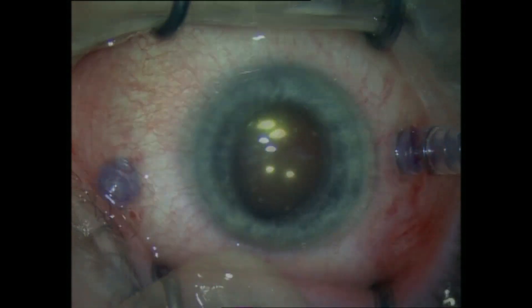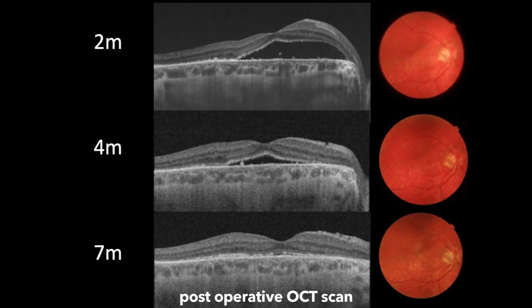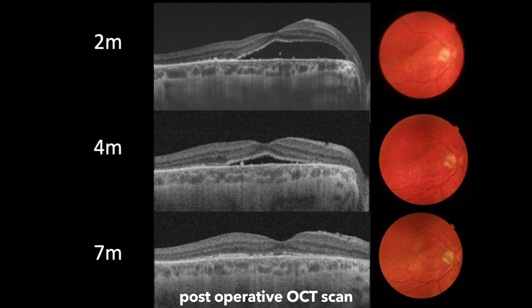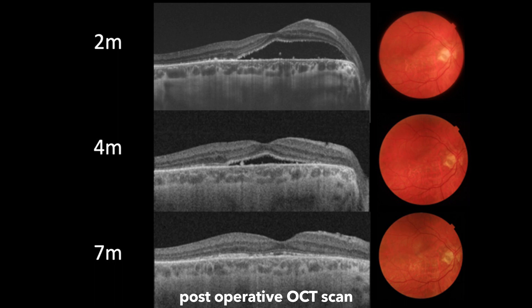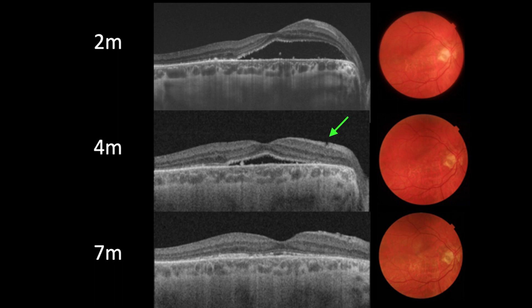All trocars were removed. The sub-retinal fluid gradually resolved after surgery, with complete resolution at seven months. The neural retina was quite healthy. One of the scans shows a very subtle defect, possibly at the area where the inner fenestration was made.